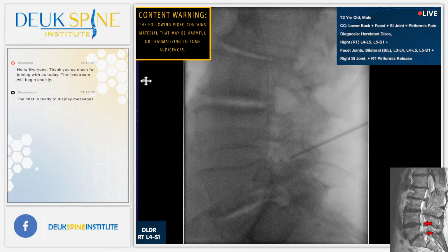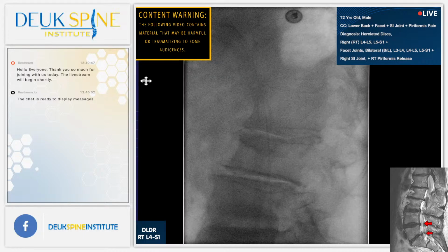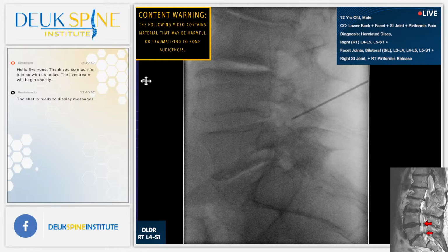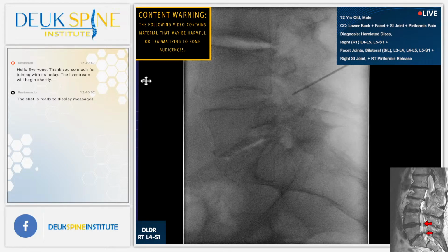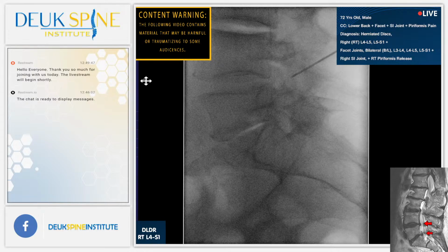Shot? Is it? I'm not so sure it's worse. Let me release the wag. Shot. Shot. Shot. Shot. That looks better to me. You're off on orbit.